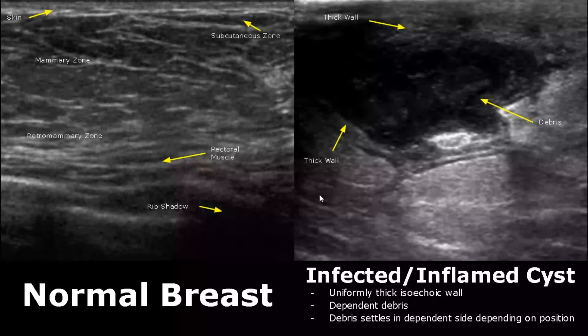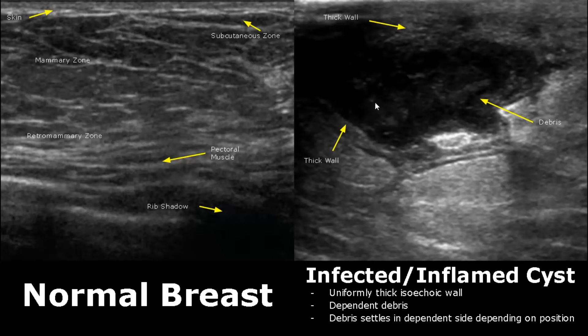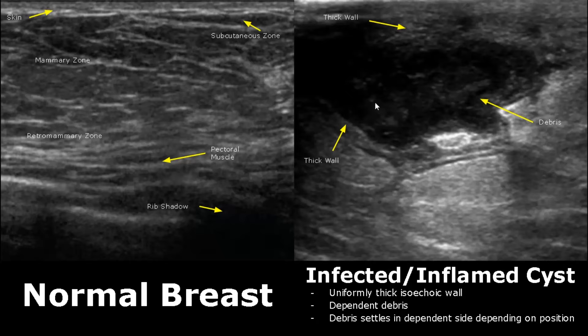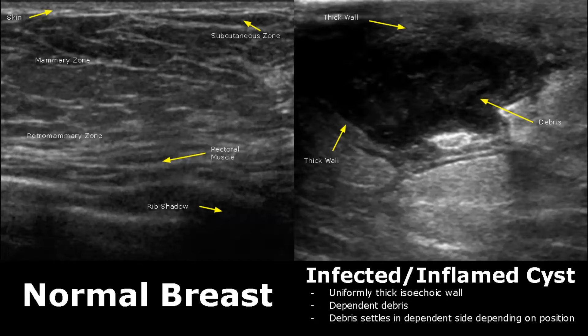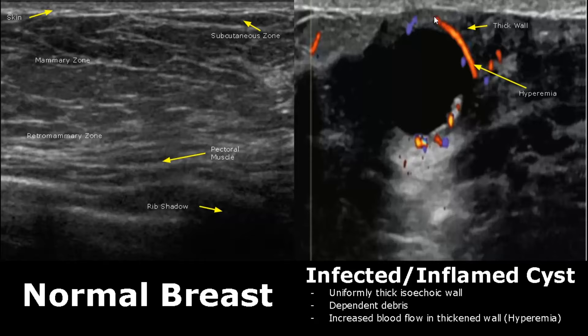Here we have a case of an infected and inflamed cyst. It has thick isoechoic walls and dependent debris, meaning the debris settles due to gravity and moves in accordance with patient position. This feature helps differentiate it from a mural nodule. On Doppler, there is increased blood flow in the thick wall.